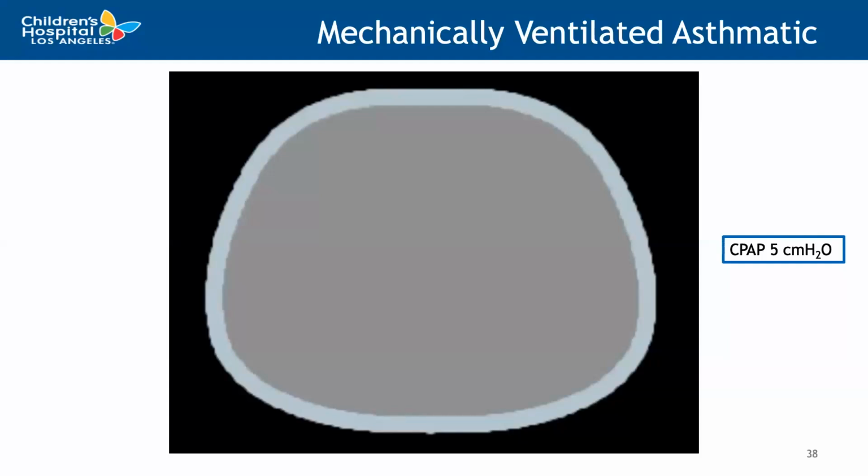At the time of EIT, the patient was simply on a CPAP trial, and they were unable to pass. Our standard SBT, or spontaneous breathing trial, in our PICU is we put the patient on a CPAP of 5. We usually do this for several hours, and we're monitoring for changes in vital signs as well as work of breathing. And this patient was continuing to fail their SBT for work of breathing.